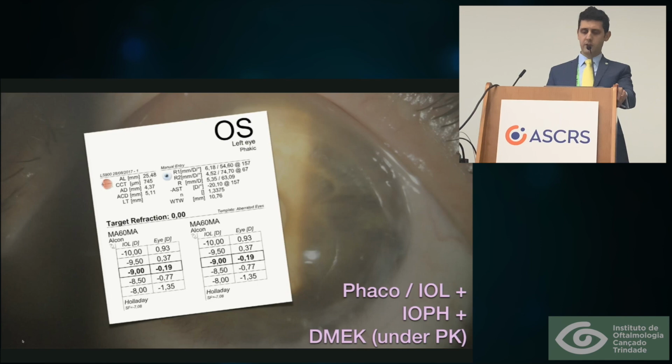So we thought about killing the aberrations and the irregular astigmatism with the pinhole, and combining that with DMEK to restore the transparency of her old graft. So that's what we did.